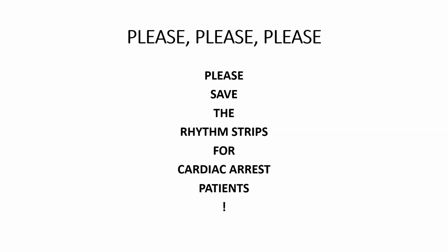So if there's any way those rhythm strips can be saved and passed on to the treating hospital or given to the family members. I've had that happen before where they've hung on to it and then they bring it and show us.